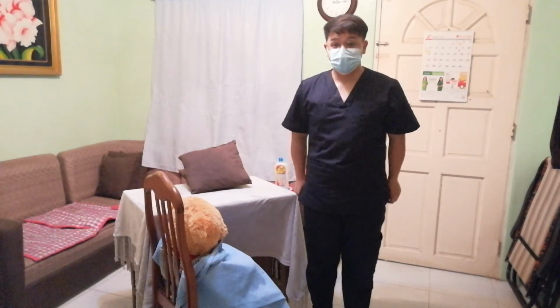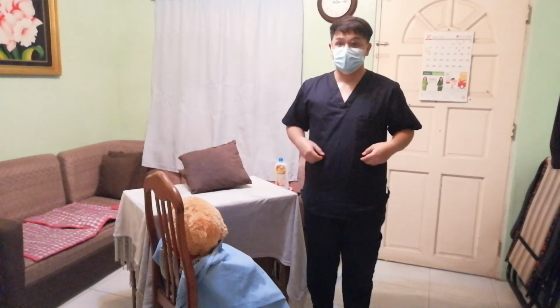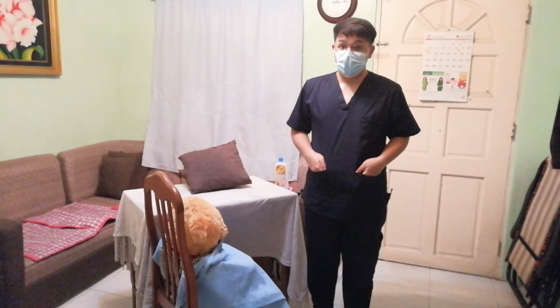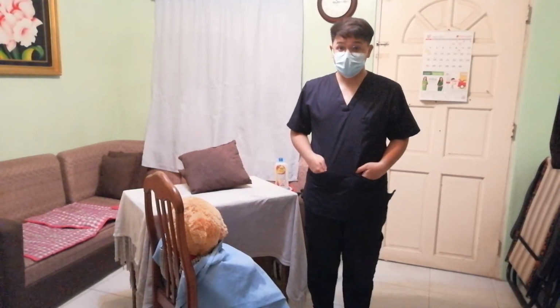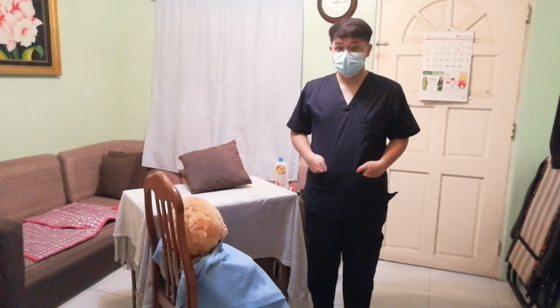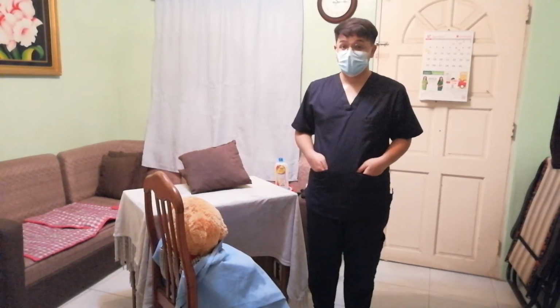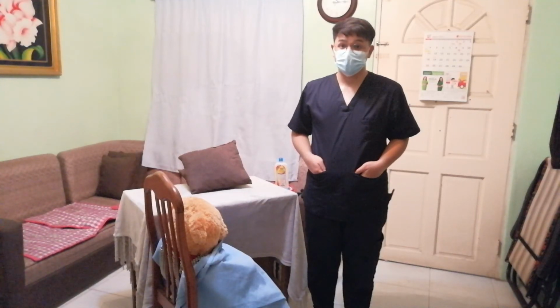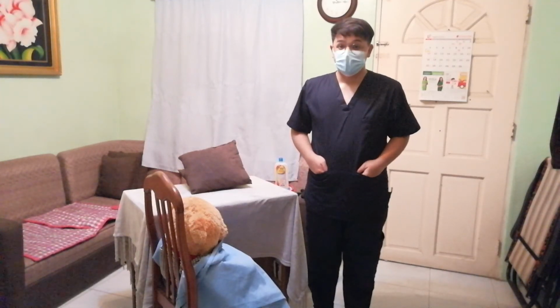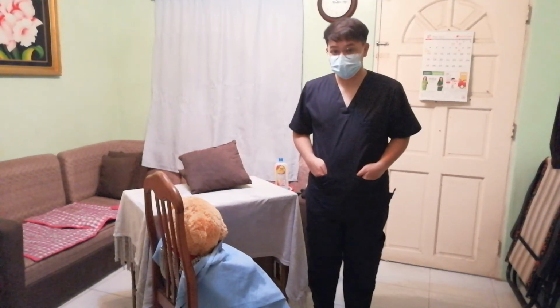So for our evaluation, the patient transfers from bed to chair or wheelchair without any injuries and exhibits no signs and symptoms of problems or complications related to immobility. And also, in addition, the nurse remains free from any injuries during the transfer.